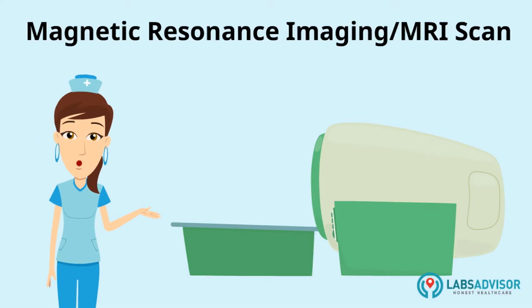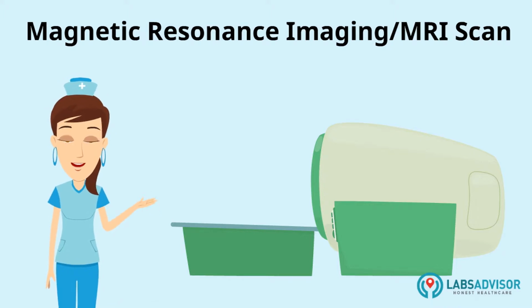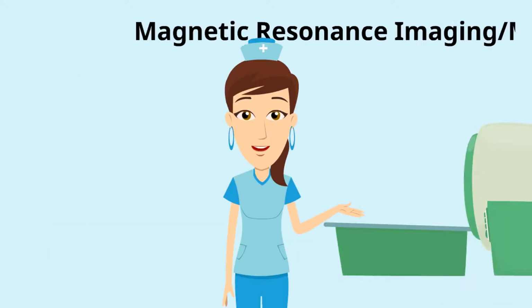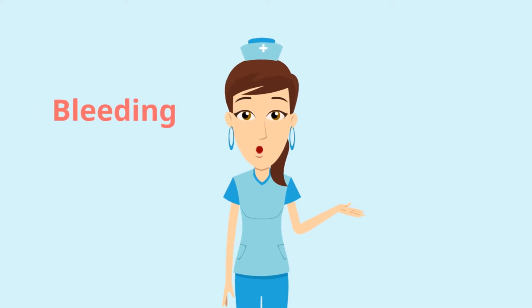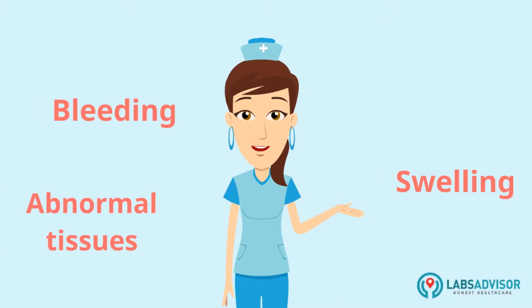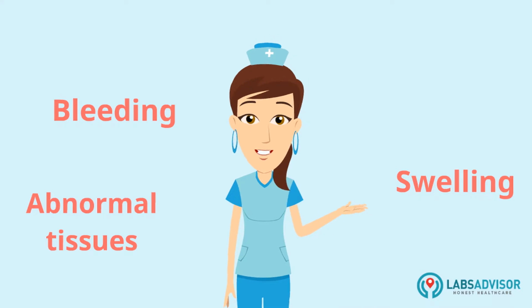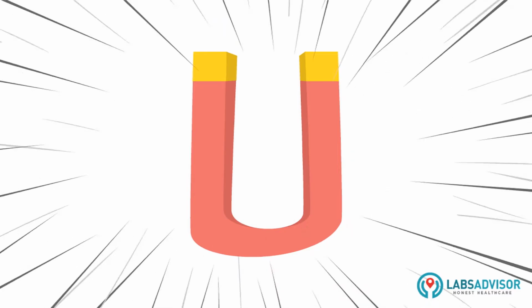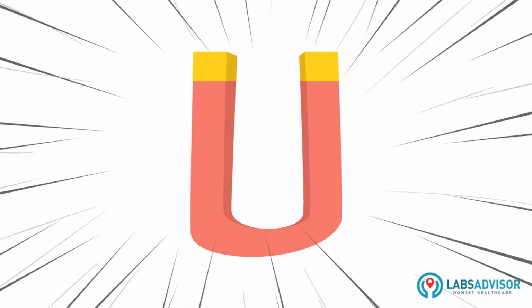Magnetic resonance imaging, or MRI scan, is a common non-invasive imaging technique used by doctors to detect any abnormalities in the body. It is one of the most accurate imaging methods to diagnose certain medical conditions. An MRI scan can detect bleeding, swelling, and abnormal tissues in any part of our body. MRI scan uses strong magnetic fields and electromagnetic pulses to capture images of the internal organs.